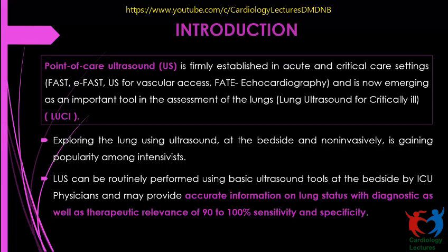It explores the lung using ultrasound at the bedside, and it is non-invasive. It is gaining popularity amongst intensivists. Lung ultrasound can routinely be performed using basic ultrasound tools at the bedside by ICU physicians and may provide accurate information on lung status, with diagnostic as well as therapeutic relevance. The sensitivity and specificity, compared to high resolution CT scan, is around 90 to 100%. So it is a very good bedside tool for assessing the patient without shifting the patient to the high resolution units and getting the irradiation.